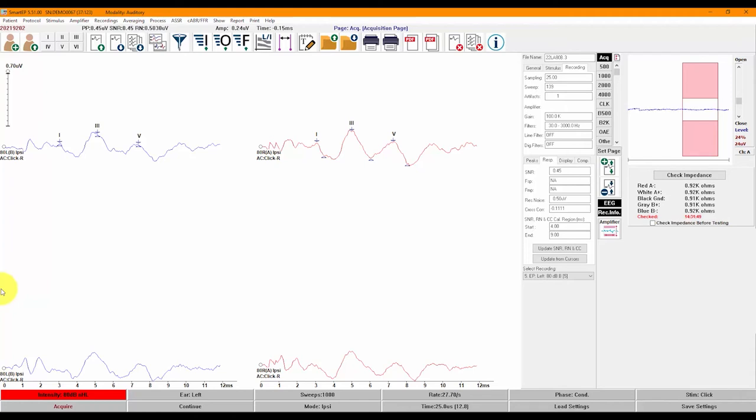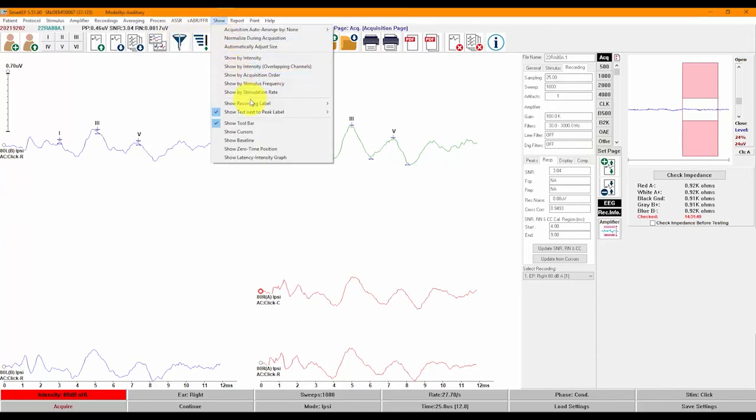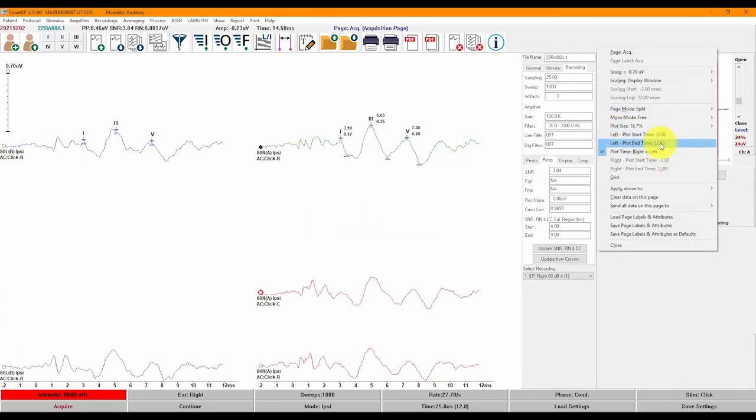FSP and FMP values can be calculated when recording in blocks — this can be activated in the Averaging menu. You can easily zoom recordings in and out using the zoom buttons: plus zooms in and minus zooms out. A horizontal baseline can also be shown for each recording, activated from the Show menu. Another display option is the ability to show the latency and amplitude of a recording right on the waveform. For those who look for the cochlear microphonic, you may find it useful to set your display to start from negative 2 milliseconds. You can change the display time window from the Set Page menu or by right-clicking on your page.